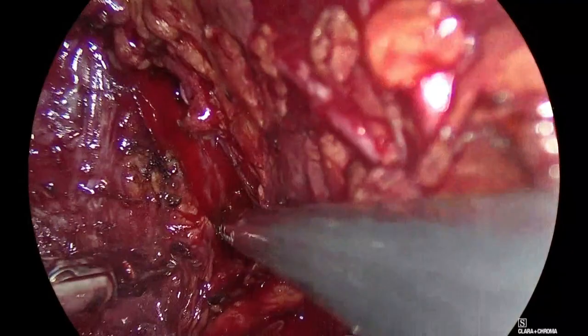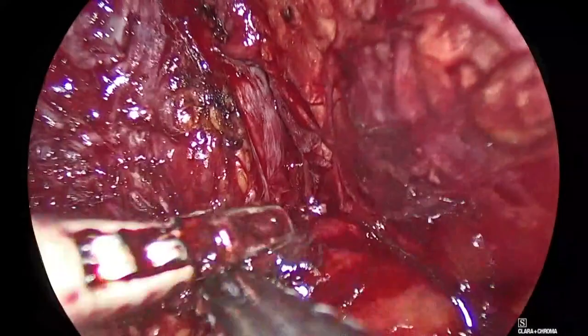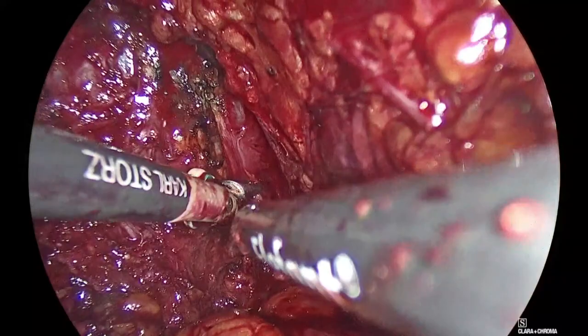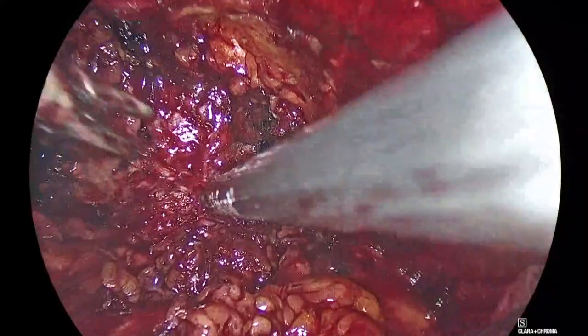So Evangelos, you seek to preserve the bladder neck, presumably? Mostly, yes. I don't know if I will manage in this case. When possible, yes. You'll ask me why, because just as you do, it seems logical that it's better. It's not proven. I like it more. I like to see it more preserved. I know there's literature not backing up what I'm saying right now, but it makes your anastomosis better, easier. Go central. But not every time is possible, eh? Go central. Central, come in.